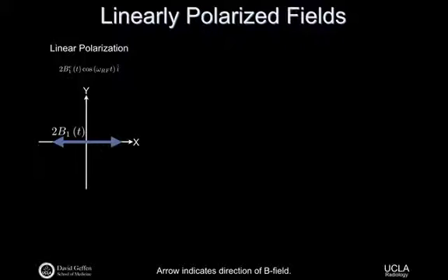So again, transverse plane, just to get us oriented again. We're looking down the axis of the scanner in the laboratory coordinate frame. I could design a B1 field that just oscillated back and forth, right? That'd still be a useful field.